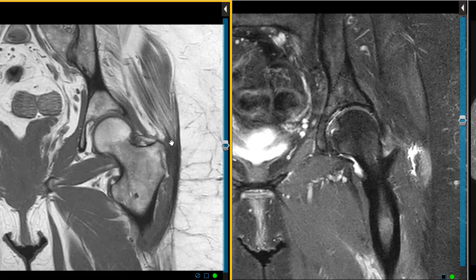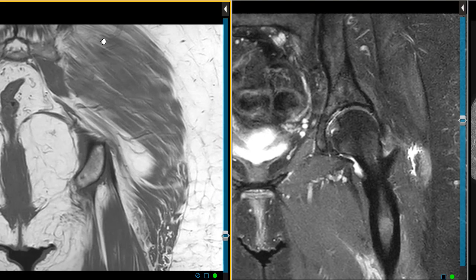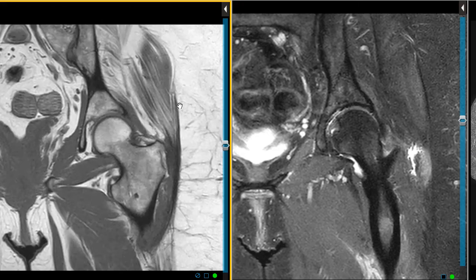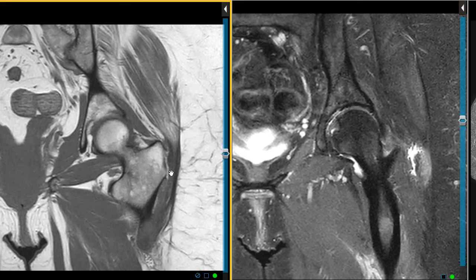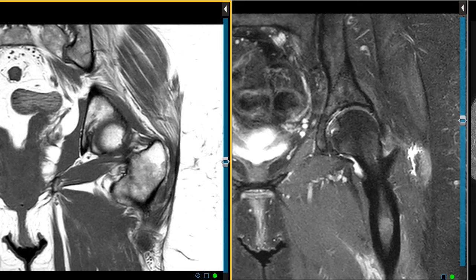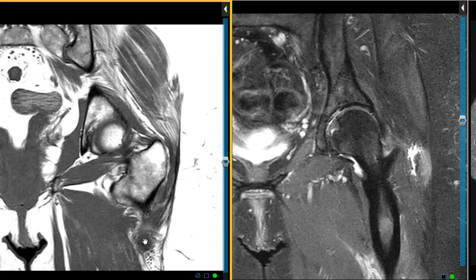Now the gluteus maximus, the biggest muscle, heaviest muscle in the body, is right here. The gluteus maximus muscle comes back down around, wraps over, goes behind the femur, and then it comes down here and attaches to a couple areas. Number one, the iliotibial band, this broad sheet. This fascia coming down here, it attaches to that. And it also comes back behind the femur and attaches to the back of the femur, right along the back margin. And if we go towards the back, we'll see this area right back here, a little area of darkness, which is unusual, and that's right at the lower attachment. This is part of the muscle coming over, and right there, this little round ball is right where that attaches.